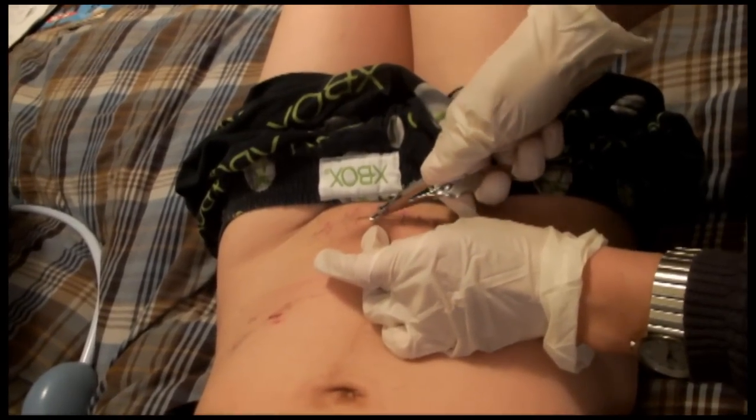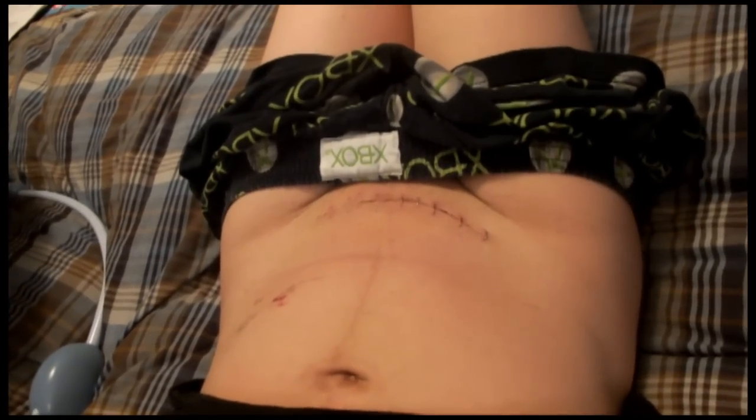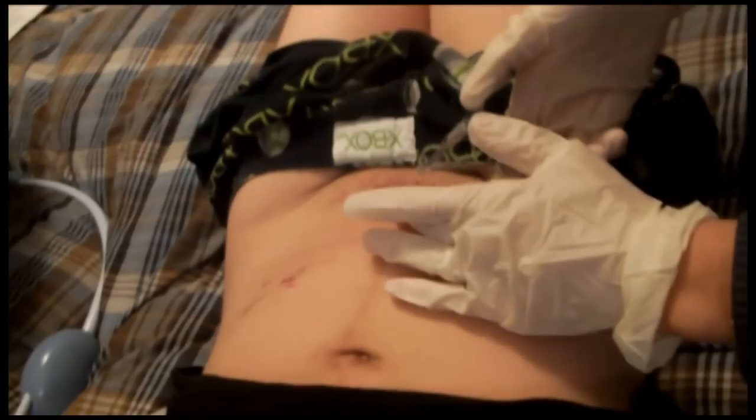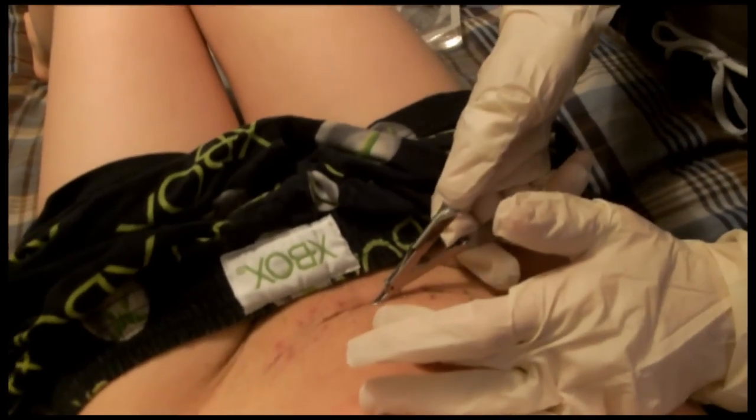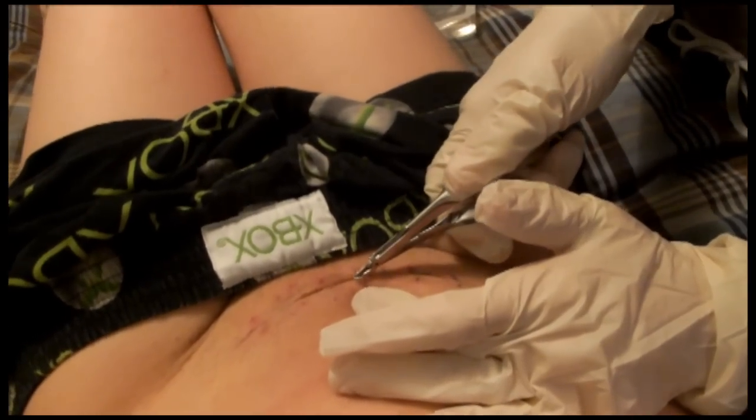So the side that's still weepy — if the staple comes out, isn't it just going to fall open? No, it might separate a tiny little bit, but it's still mostly healed on the inside. So even if the skin separates a little bit, it's okay. It all heals kind of from the inside out. It's amazing what the body can go through and just recover from.